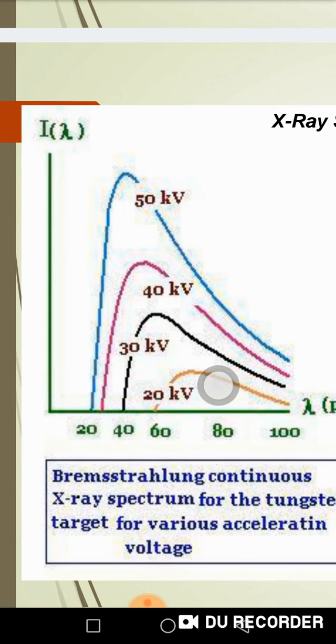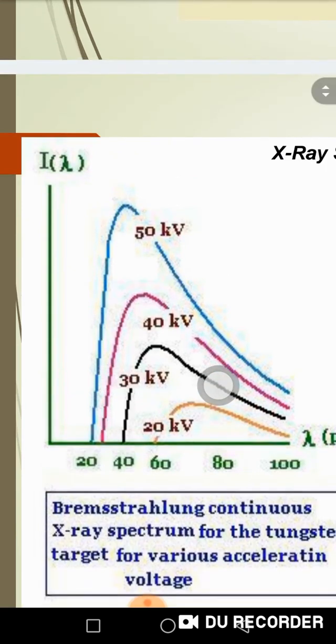When I performed the production, I used kV 120 and kV 50. You should know that the maximum energy of a photon that will come out of the tube will carry 50 kilovolts. Therefore, when you set it to 50 kilovolts, a spectrum of photons will appear, not just a single energy.